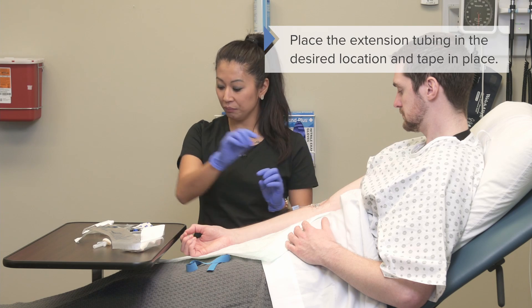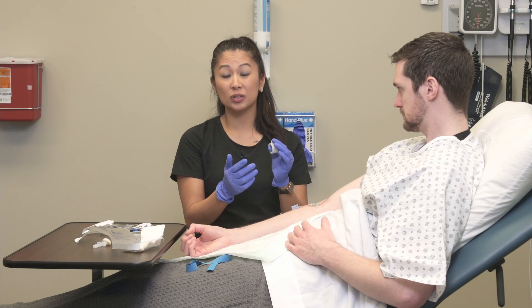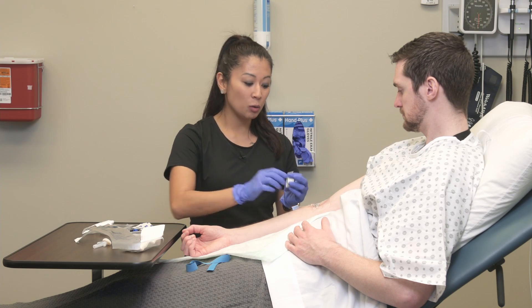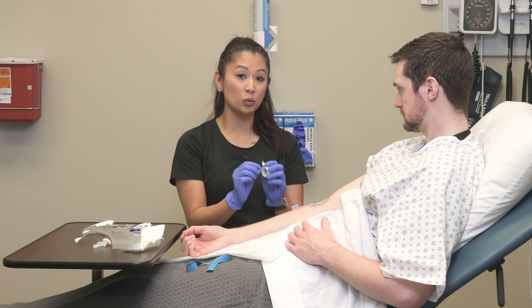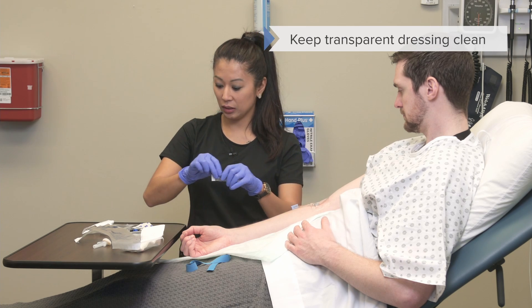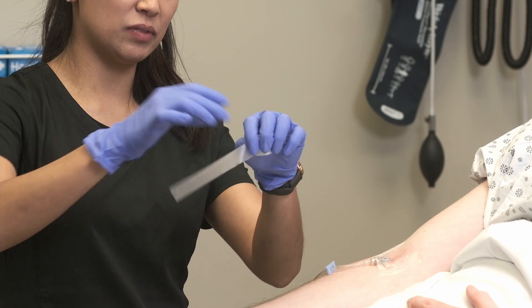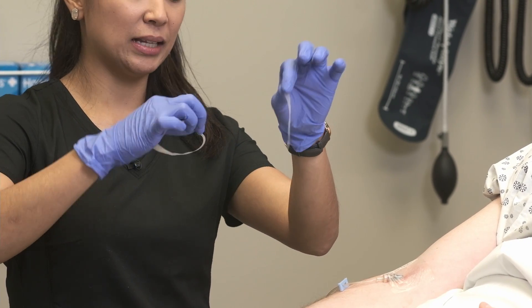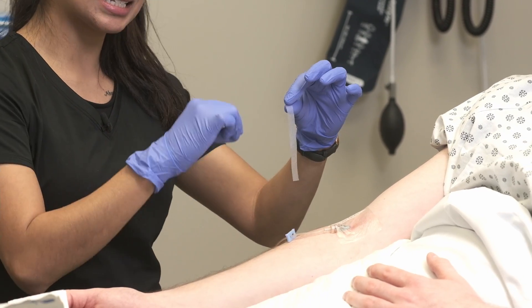Now that we've got this taped down, I'm going to secure it better because anytime this is in a patient's arm it can get tugged or move around. There are lots of different ways to tape — I'll show you how I do it. Note that under the transparent dressing, unless your facility uses a stabilization device, we should not use tape underneath — we want to keep everything clean and sterile there. This tape tears very nicely, so I'll use a generous piece and split it down the middle, which is nice. You can even save the tape on the back of your glove. Then I'll slide the thinner strip underneath the extension tubing.